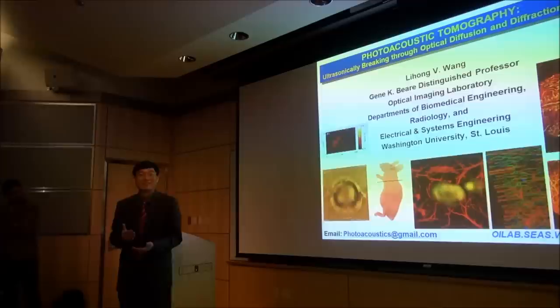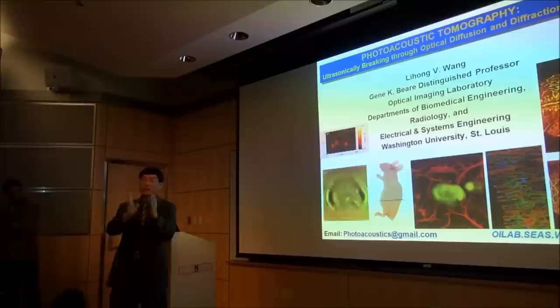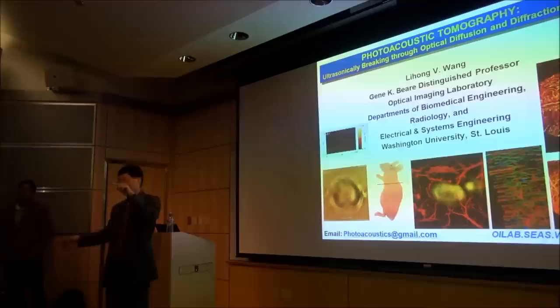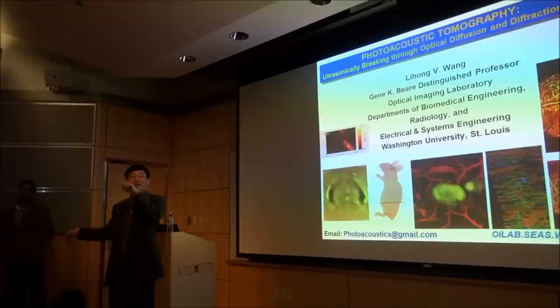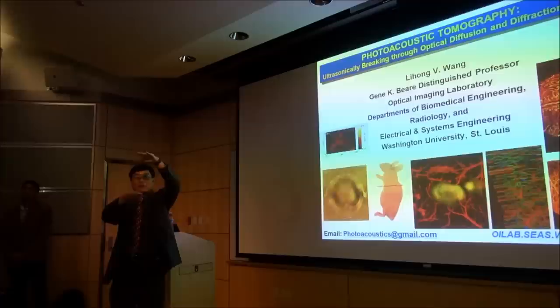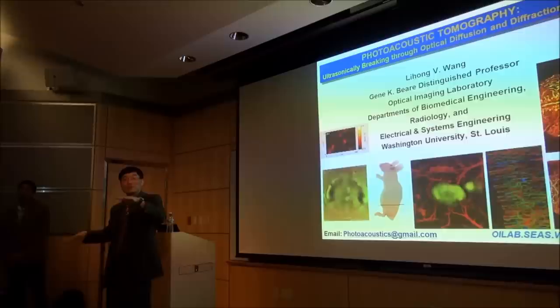You look at the visible spectrum range: at 420 you have the Soret band, and then at 560 you have the Q band. But there's already an order of magnitude difference in absorption coefficient. Then you go to the red, until 700, and that's another order of magnitude difference. So you're talking about two orders of magnitude difference within that spectral range already. And for deep tissue imaging, we often use red or near-infrared wavelengths. So there's one order of magnitude safety guard by ANSI, and two orders of magnitude difference within the visible spectral range.